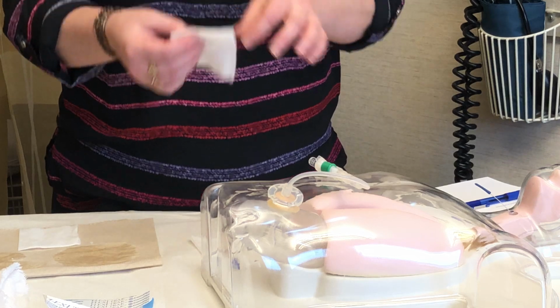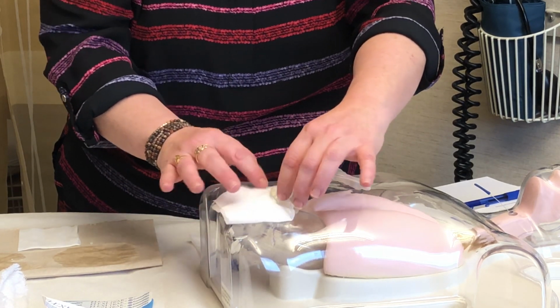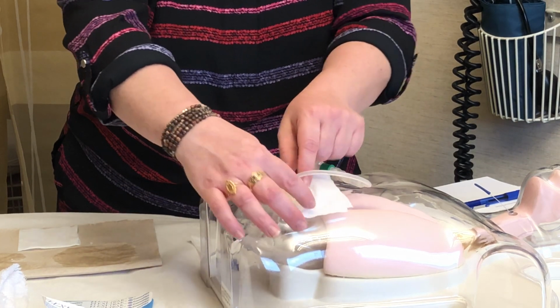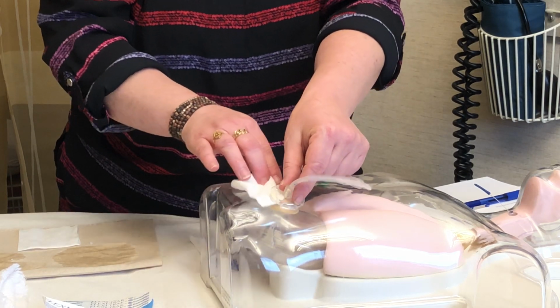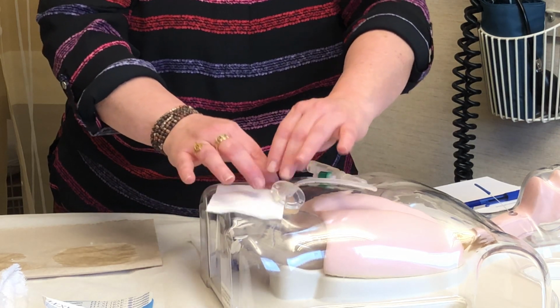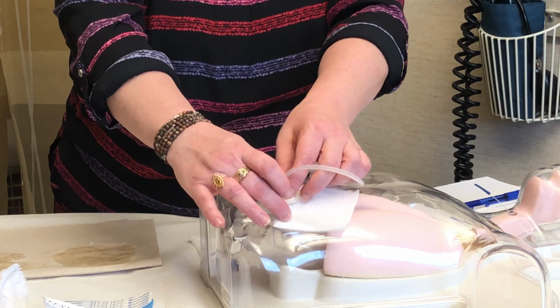Next one is a rinse one. You're going to do the exact same thing, and apply that and get that underneath your skin disc. You're going to bring that up and around. What we're doing right now is removing any soap residue that you have on your skin. Discard that one. Now we have a dry one. We basically don't want any moisture underneath that skin disc, so you can either go all the way around or just pat that dry.